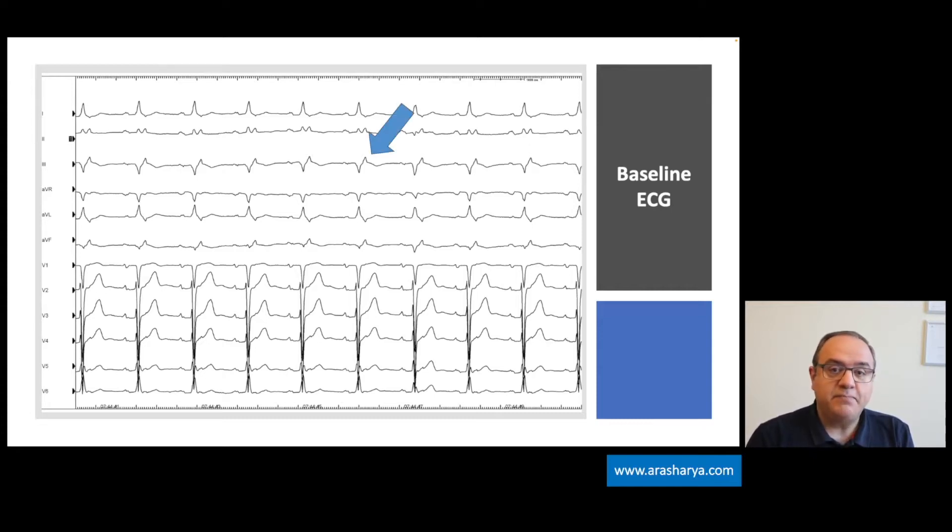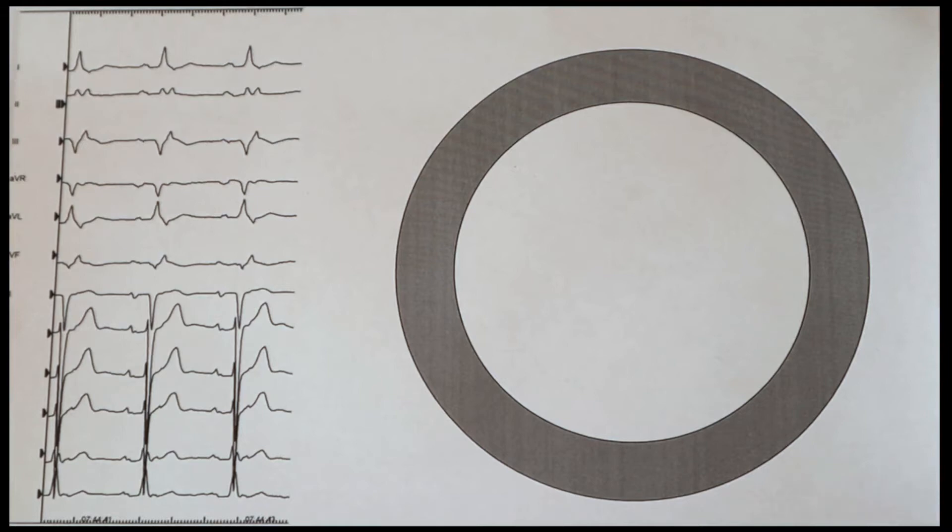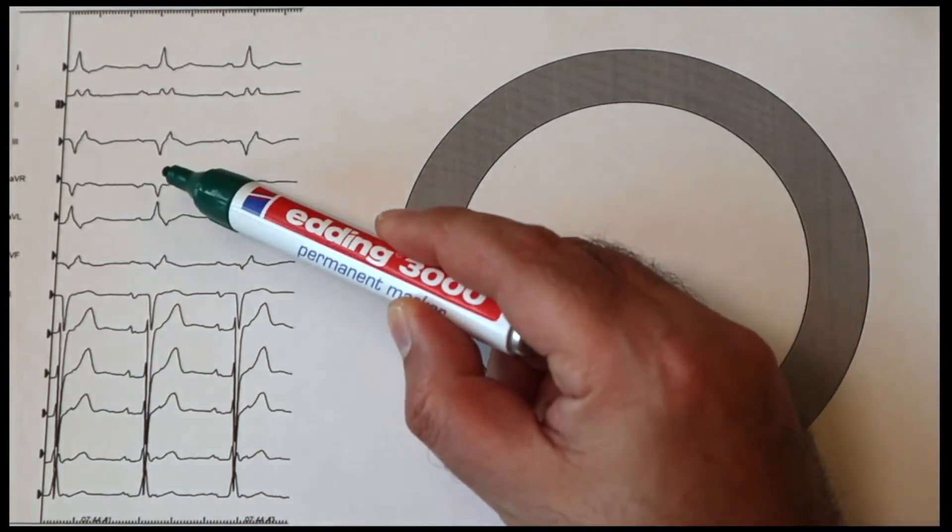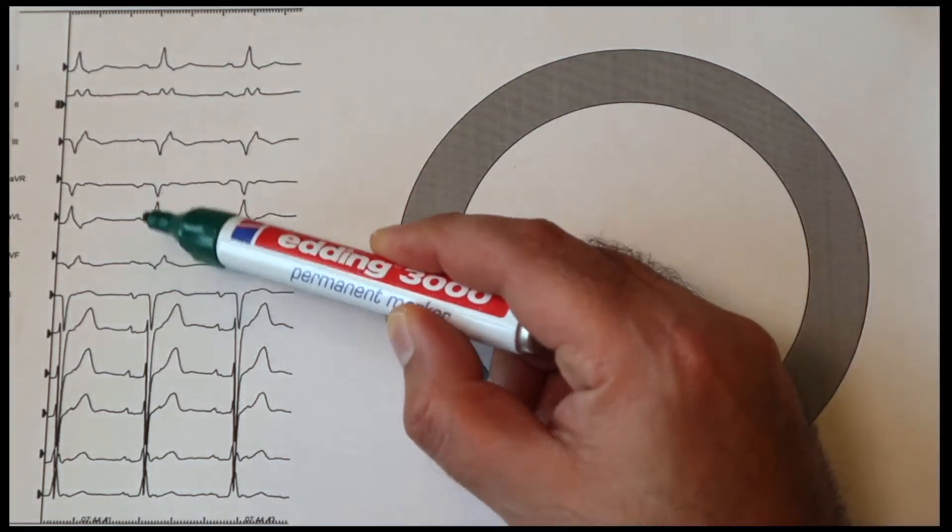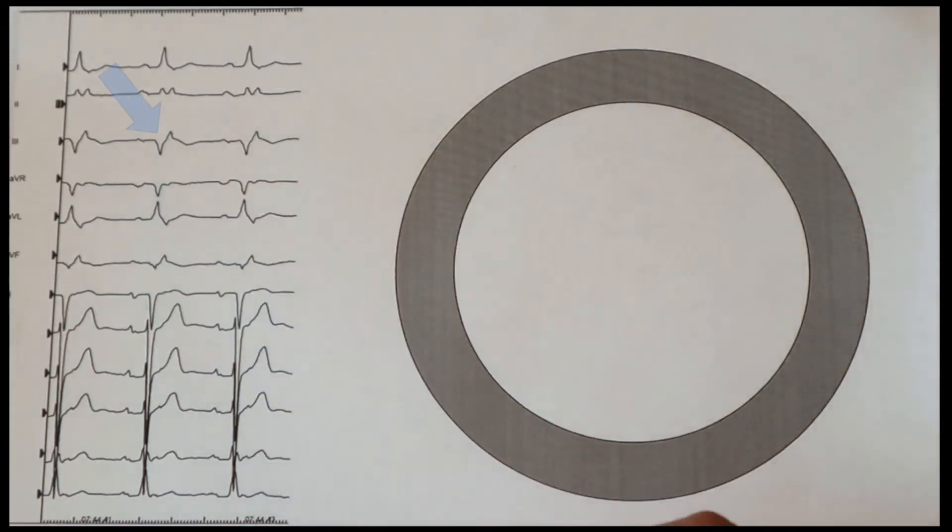Now let's look together to a short video for the explanation of these waves at the end of the QRS complex. Let's have a closer look at the ECG together. In lead III and also in lead aVF, we see a deep Q wave which shows an old inferior wall myocardial infarction.